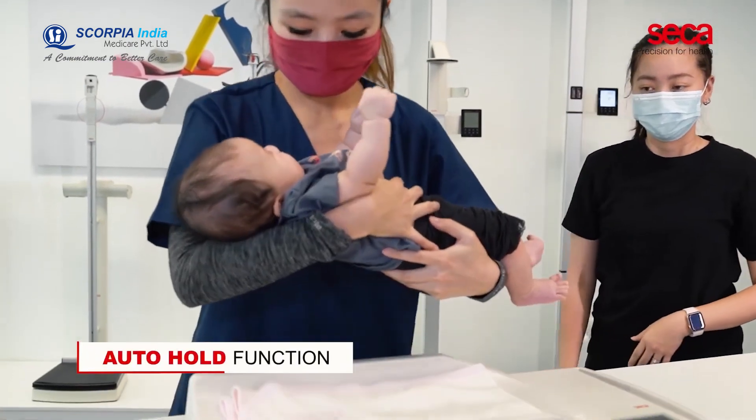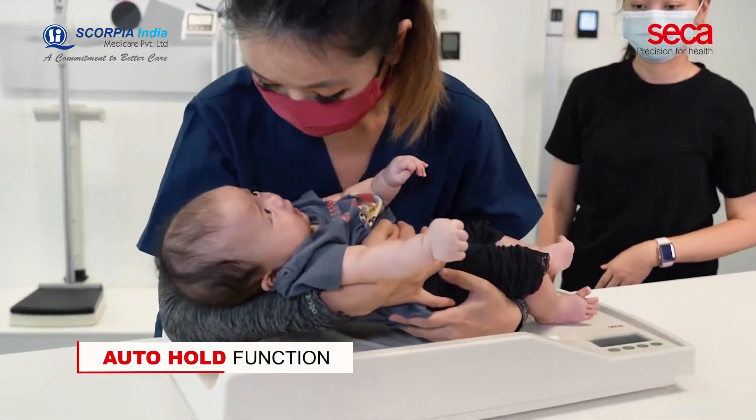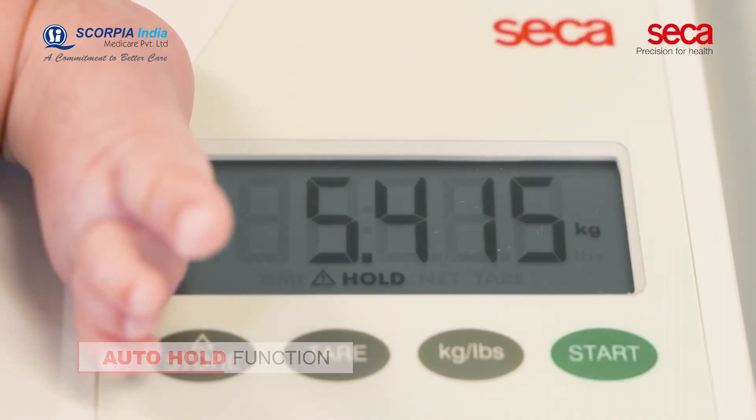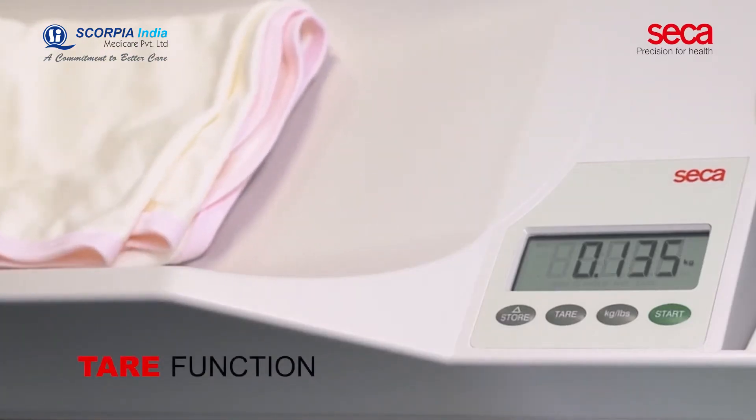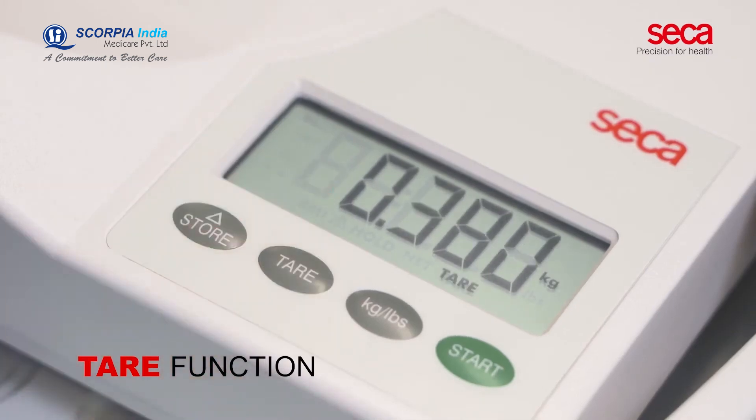With the auto-hold function, results are kept on the display whilst medical personnel attend to the patient's needs first. The tear function of the scale allows you to exclude the weight of an additional item, such as a diaper or a blanket.